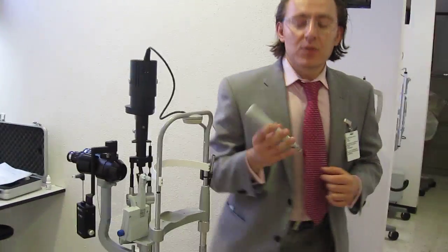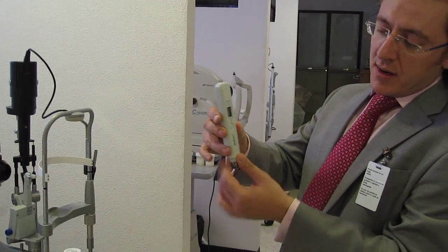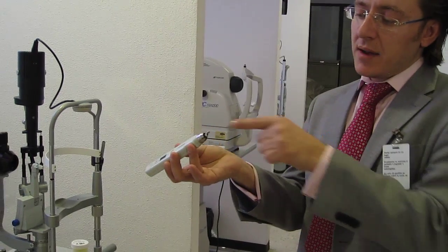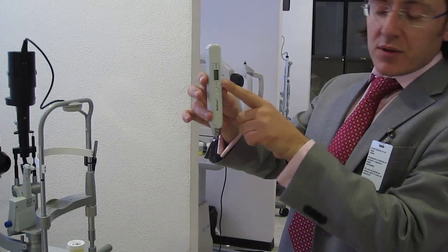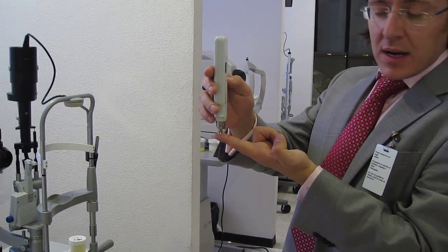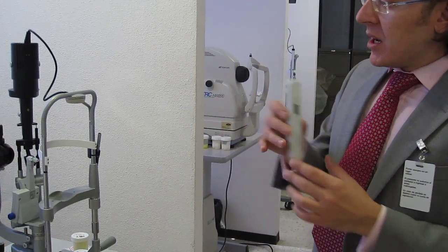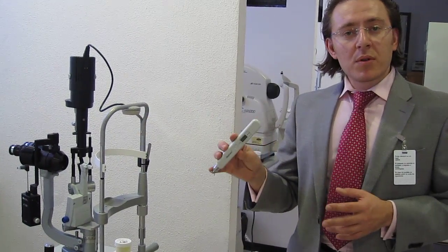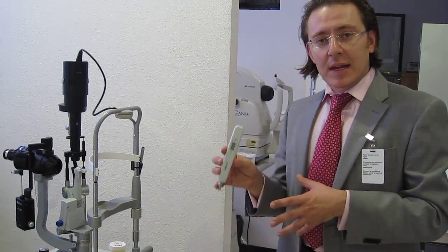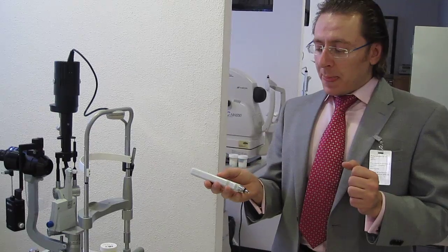What I'd also like to demonstrate is the ease of use. The way you operate it is one, two, three — three fingers on one side, a thumb on the other. Tilt back, the little floater falls inside. Come back to the initial vertical position and turn it on. Four zeros appear on the display. Place it on the upper eyelid and gently release downwards, and you get digital results. These are stationary units that are available, but this is also a portable device that does not require anesthetic drops, no tips needed, and it's quick — only takes a few seconds for both eyes.